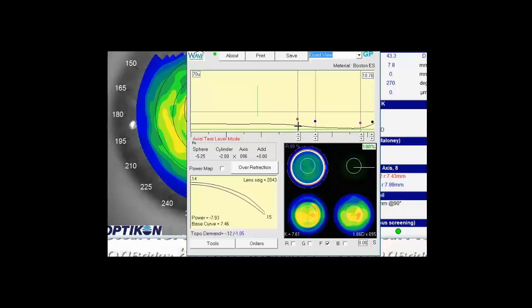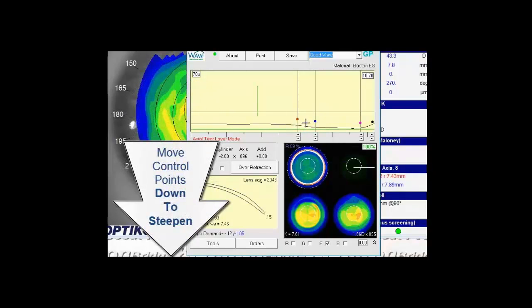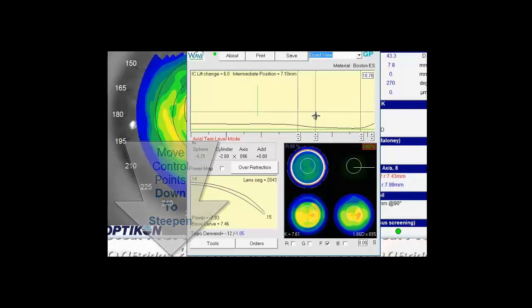If we wanted to steepen the central curve, we would just drag the red dot down. If we wanted to flatten it, we would drag it up. Same controls work on the blue dot. If we want to steepen the mid-peripheral curve, so that's going to steepen just to the left of the blue dot. We drag it down. If we want to flatten them, we can drag it up.